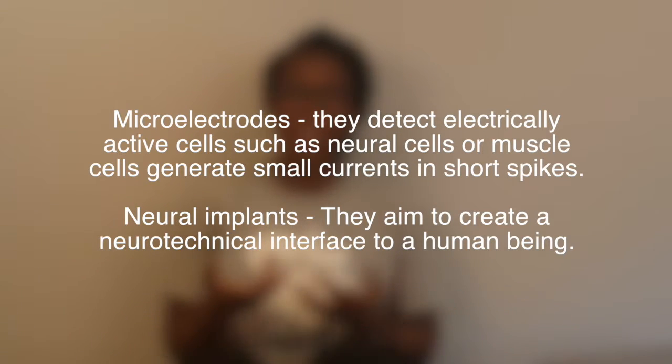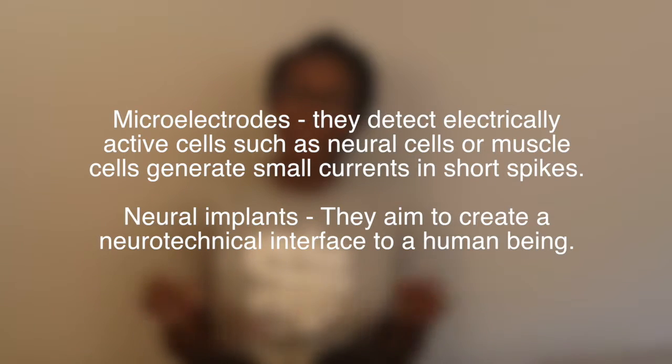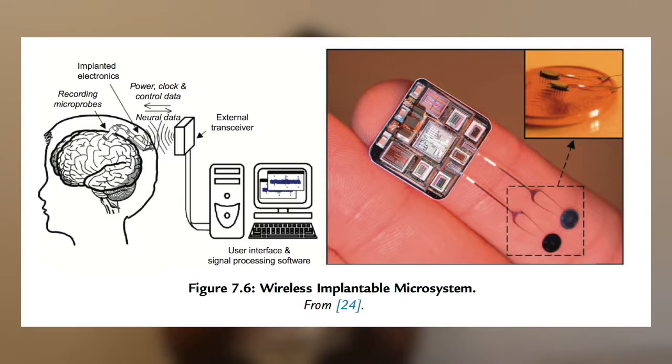Now, neural implants aim to create a neurotechnical interface to a human being. And to achieve a bidirectional flow of information, to either record neural activity or perform nerve or muscle excitation, the electrodes use electrical stimulation. So, microprobes are effectively used in recording activity in the brain.